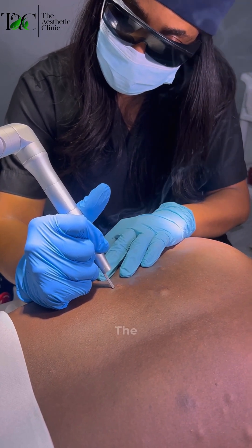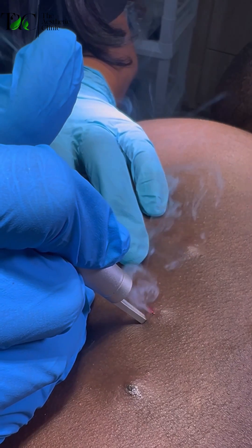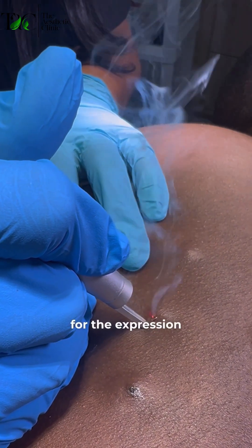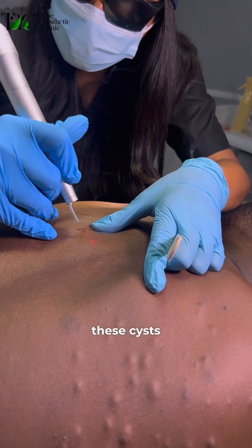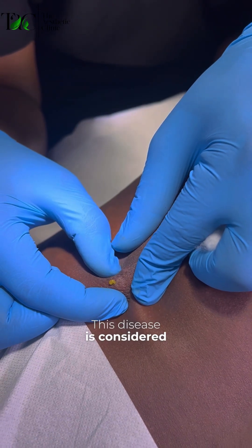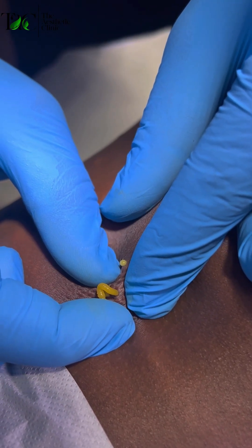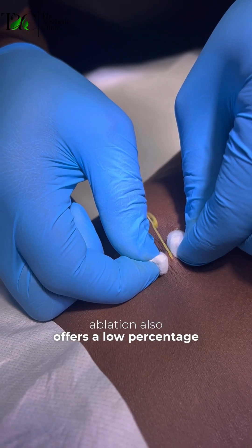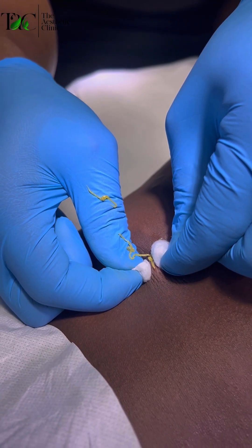This is the CO2 laser. The CO2 laser ablation helps to create a passageway for the expression of contents of the cyst. This disease is considered rare and also benign. CO2 laser ablation also offers a low percentage of recurrence and good aesthetic results.